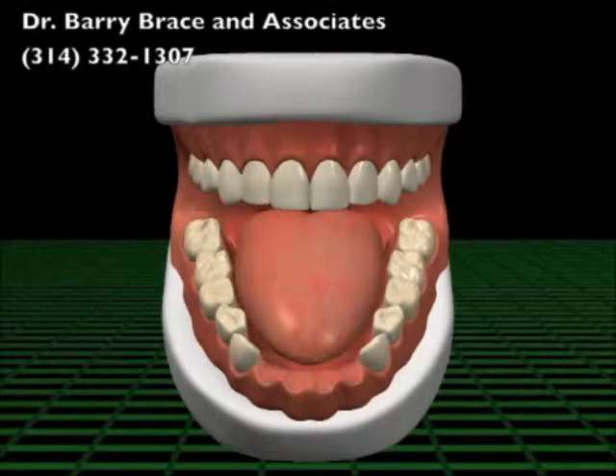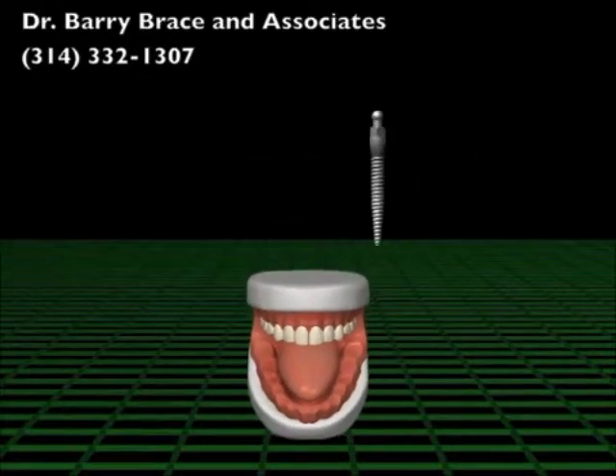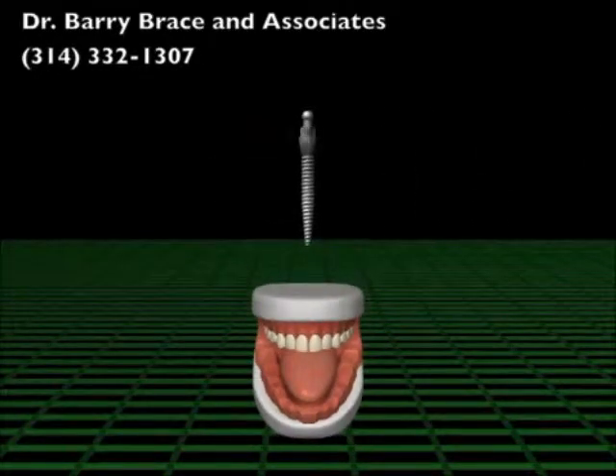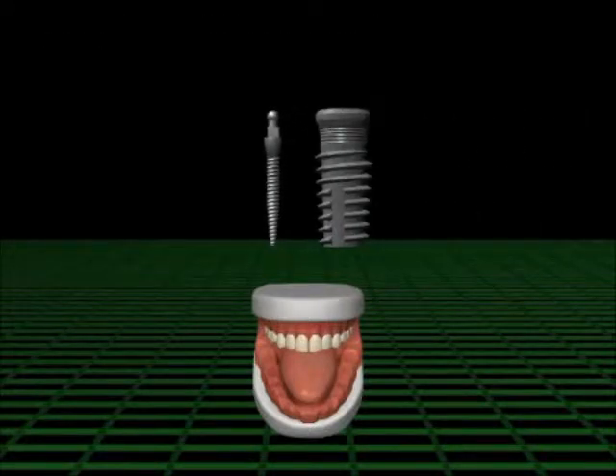The loss of teeth happens with age, by accident, or from health-related issues. MDIs are an excellent option for replacing missing teeth, stabilizing loose dentures, and may be more suitable for those with medical complications. Compared to traditional implants, MDIs are smaller in size.